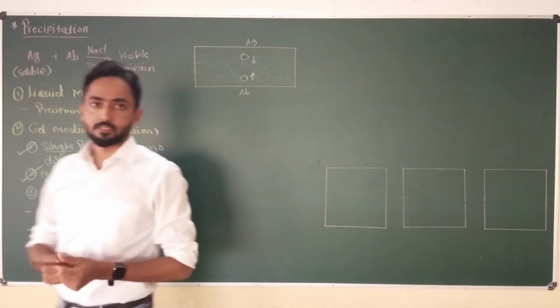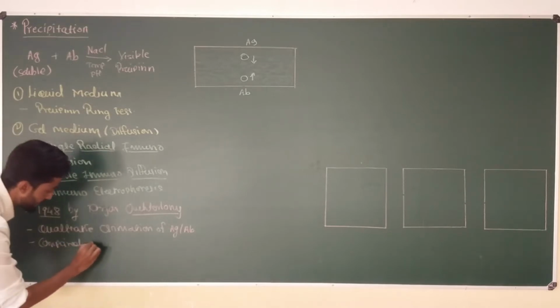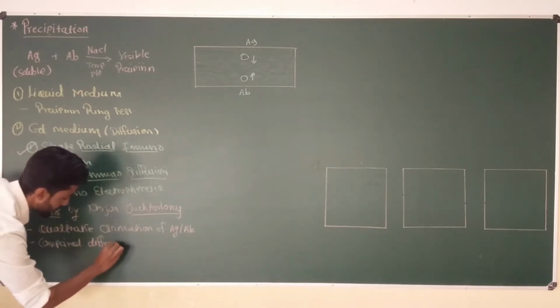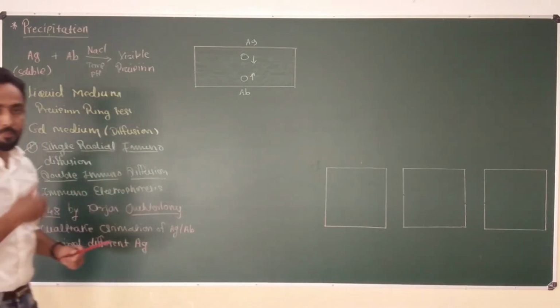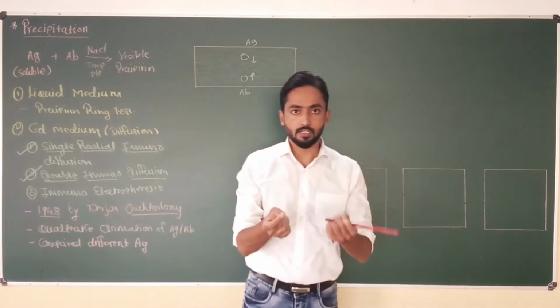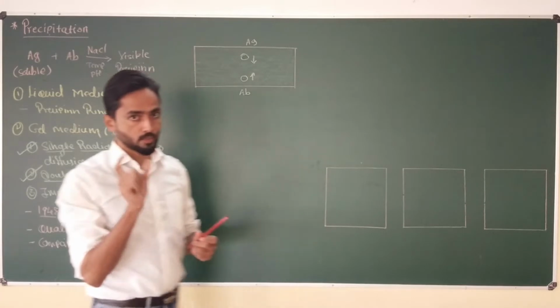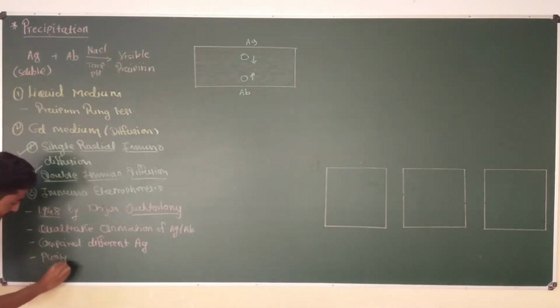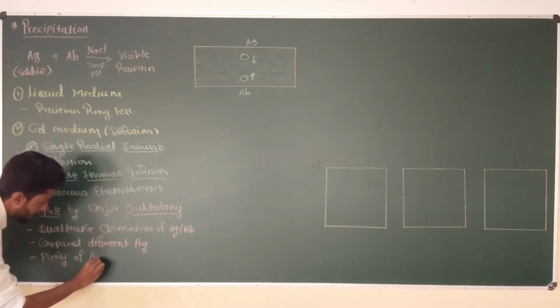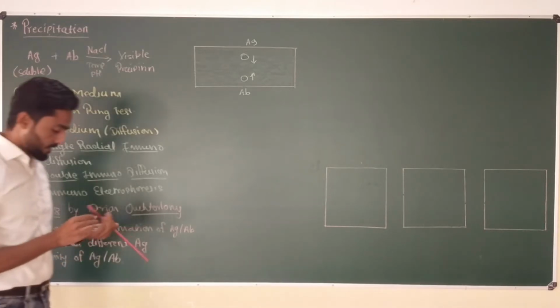Another application of this technique is that you can compare different antigens. So the technique has a comparative application. You can compare different antigens present in different samples with the help of this technique. And you can also determine the purity of the antigen or antibody by this technique.